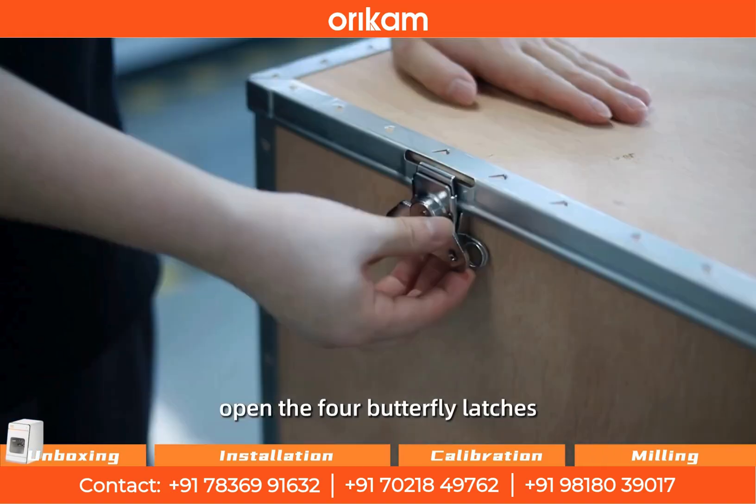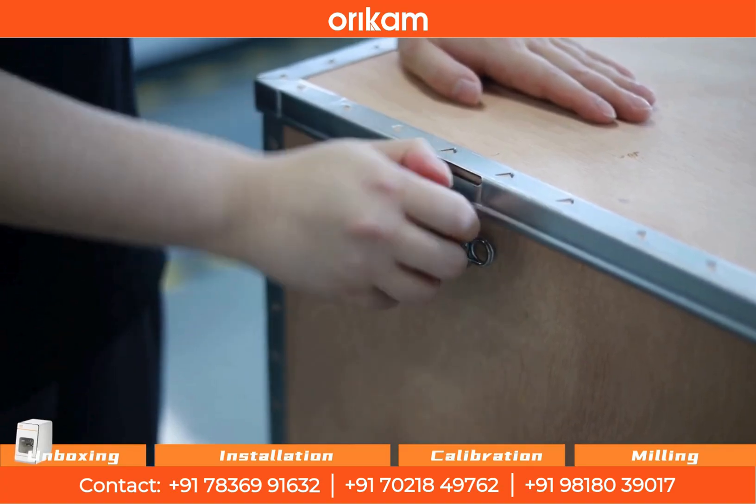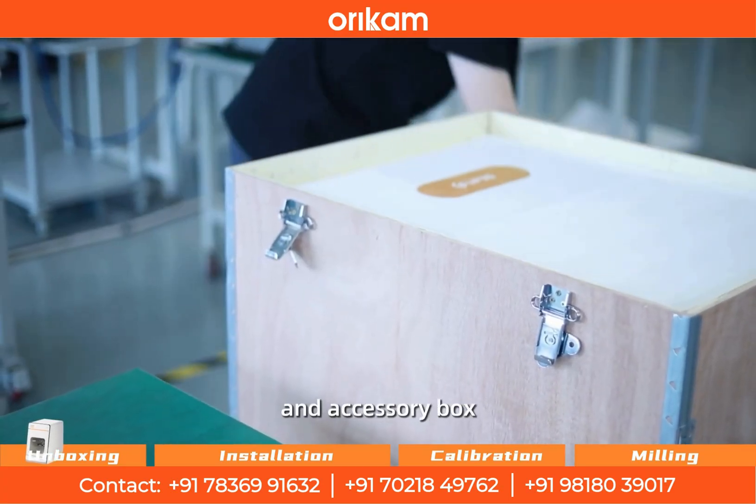Cut the strapping bands, open the 4 butterfly latches on the top cover of the wooden crate, and remove the cover. Take out the top protective foam and accessory box.